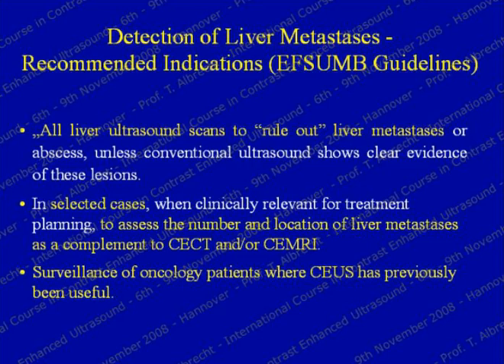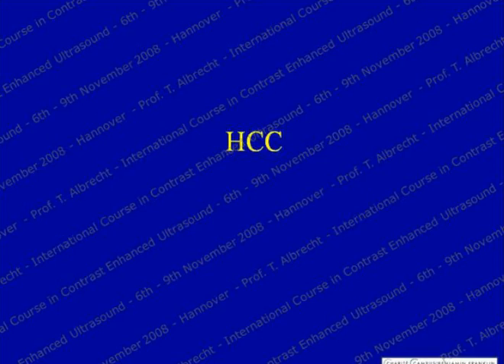The crucial point here really is all liver ultrasound scans to rule out liver metastasis. What this means is unenhanced ultrasound is inadequate if you are serious about ruling out liver metastasis. Before I finish, I want to spend a couple of minutes on HCC.